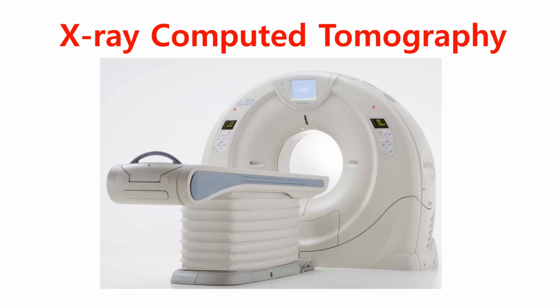The CT scanner makes use of X-rays. Here, CT stands for computed tomography. A position-dependent image parameter is used to construct the image. The image parameter in a CT scanner is the X-ray absorption coefficient. In a CT scan, the X-ray passes through various kinds of tissues and bones with different X-ray absorption coefficients.